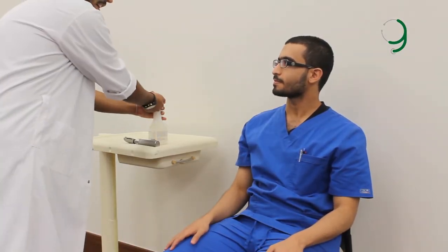Hello, my name is Abdullah Abdul Mummeh and I'm here to perform an eye examination for you. Can I have your name please? My name is Saleh. Mr Saleh, how old are you? 21 years old. Do you have any pain Mr Saleh? No. May I begin the examination please? Yes, please.